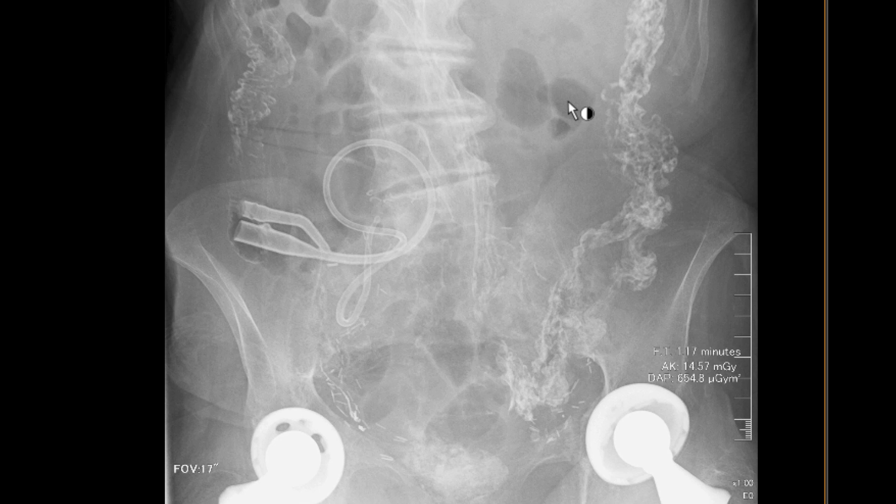This is a patient who had bladder cancer, had a cystectomy and ileal conduit placed, had a CT scan showing some hydronephrosis of the kidneys, and a loopogram was requested in order to evaluate for an underlying stricture.